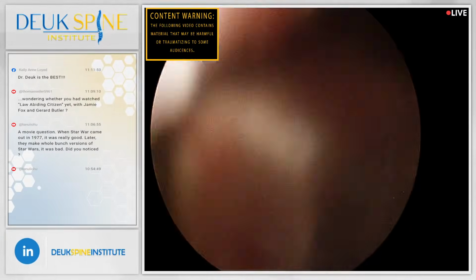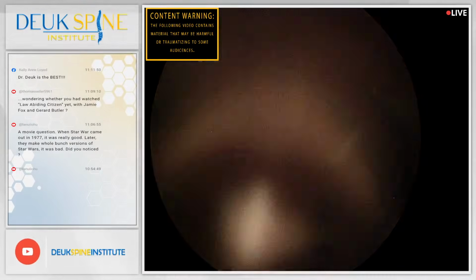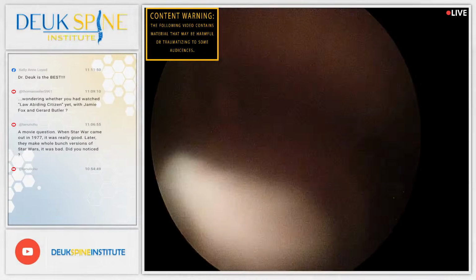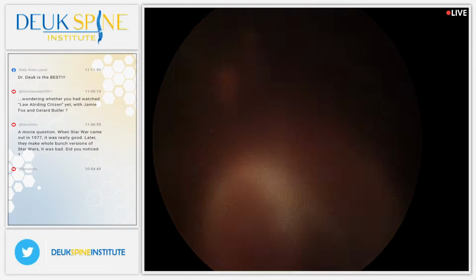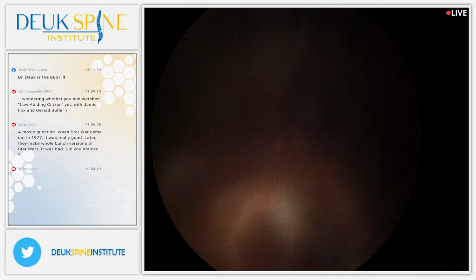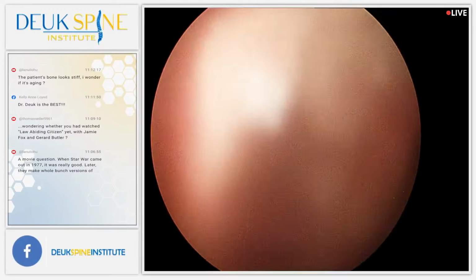How's he doing, Berndes? Good? Man, he is clamping down on this tube. This guy is just fighting us really hard, but we're going to do our best here. Thank God it's one level. But I think he's crushed my tube as well.